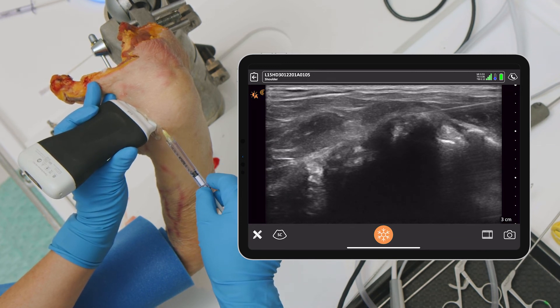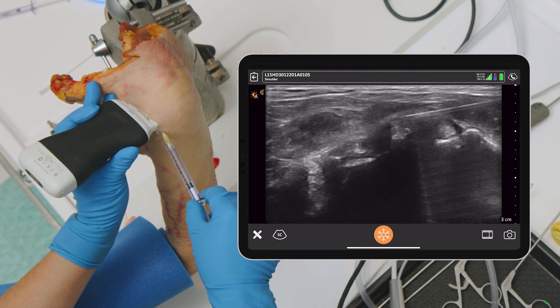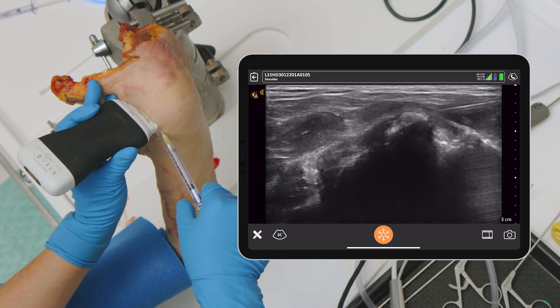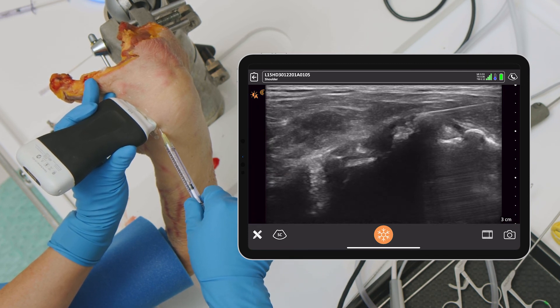There's the needle — very nice. And you can see I'm right there at the outside of the subscap. So that's what's nice about being able to see this really easily. These are really easy and quick. What's nice about these is they'll be easily tolerated by the patient. So if you want to come down and hit that subscap area, there you go.